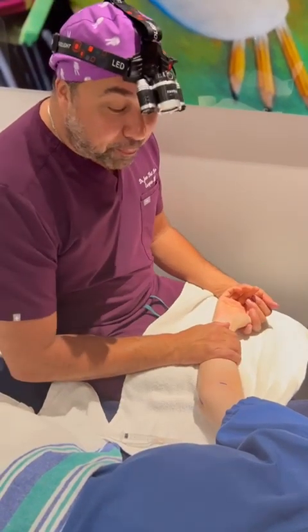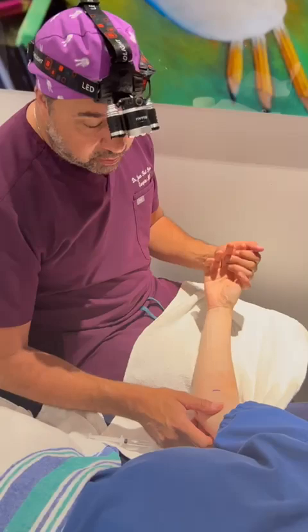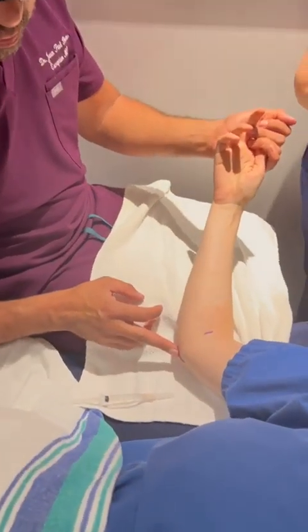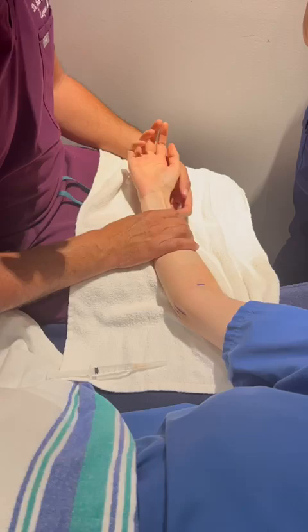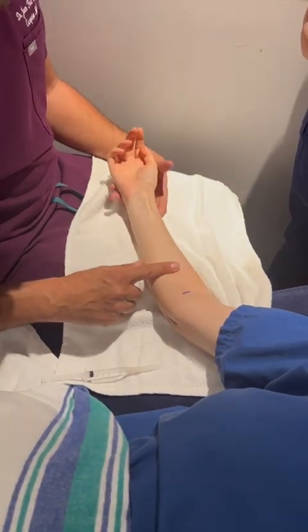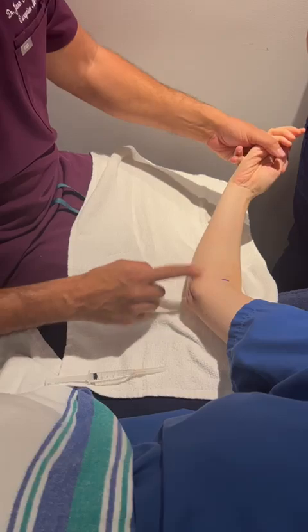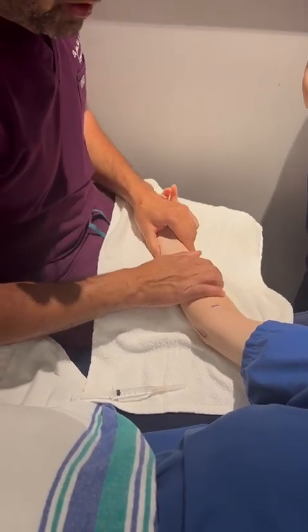We're going to demonstrate how to do painless anesthesia for this patient who has Lassertus syndrome and Cubital Tunnel Syndrome. The goal is to numb this area with a wide awake local anesthetic solution, but without hurting her.